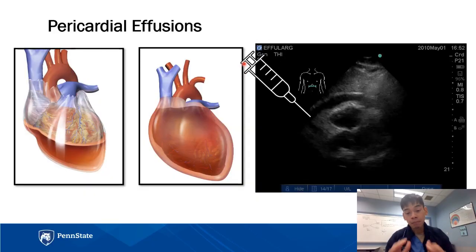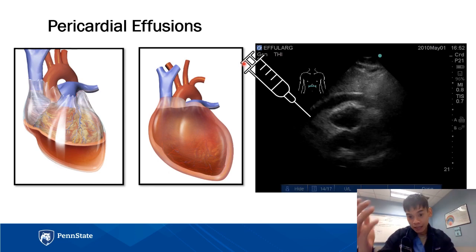And although this is not part of this curriculum and is out of scope, you can see how this eFAST exam would be essential, especially if you don't have a CT scan right at bedside or anything. You could take out an ultrasound, see if they have any free fluid. And the next question for you or your team, clinician, is can you tap this? Can you drain this? Okay.